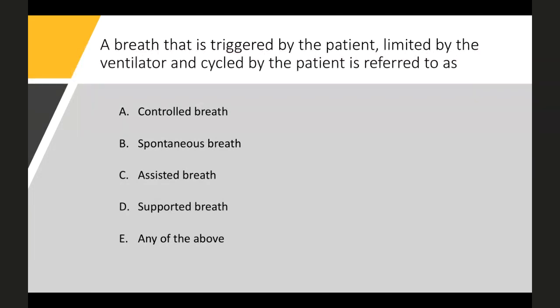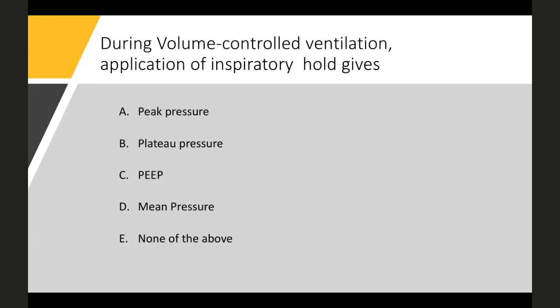Okay, fine. So during volume control ventilation, application of an inspiratory hold gives what? You can't go wrong on this. Here everybody can attend. It is a unanimous decision. Most of the participants have mentioned plateau pressure for this question. Okay, so I think that makes our life much easier for day 2 when we discuss driving pressure and all. Since our audience is familiar with the plateau pressure, we are happy for it.